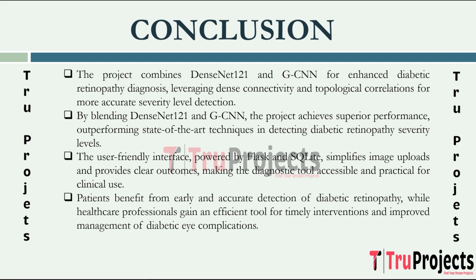The automated diagnostic tool developed in the project directly benefits patients with diabetes by enabling early and accurate detection of diabetic retinopathy. Additionally, healthcare professionals can gain a valuable resource for efficient diagnosis, allowing for timely interventions and improved management of diabetic eye complications.